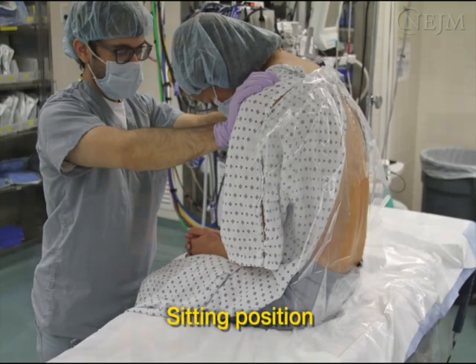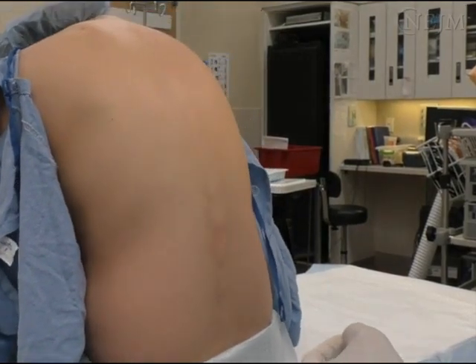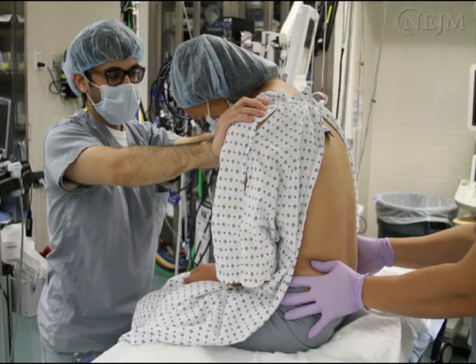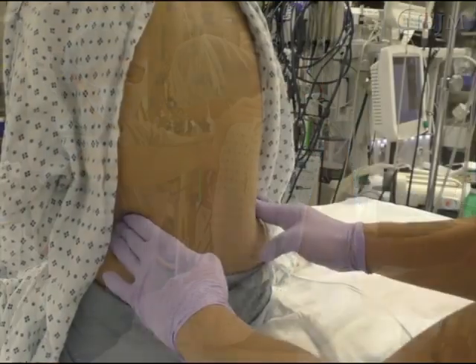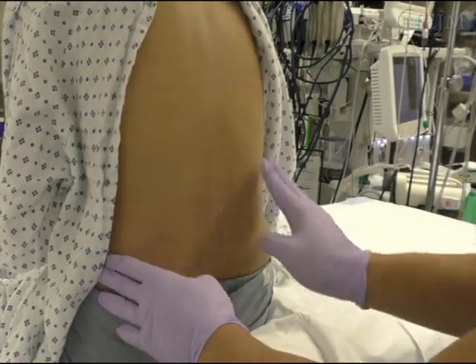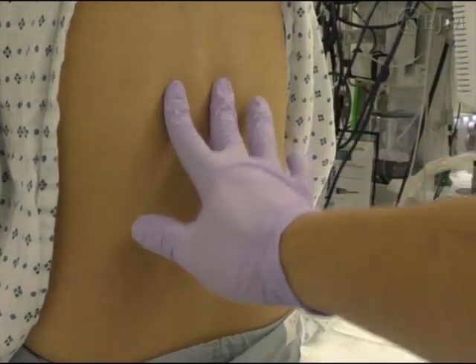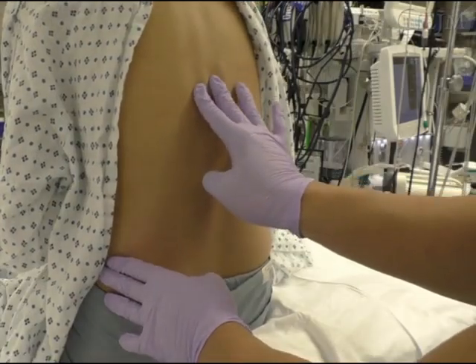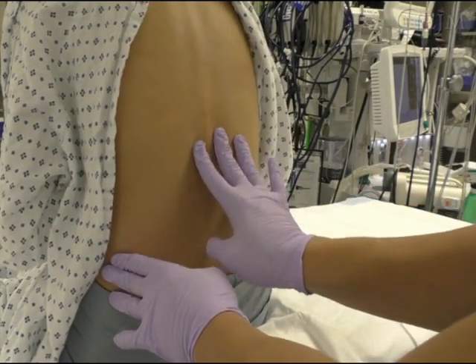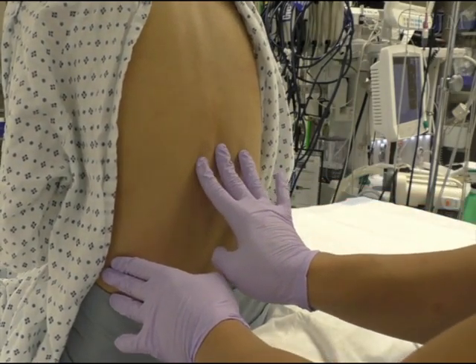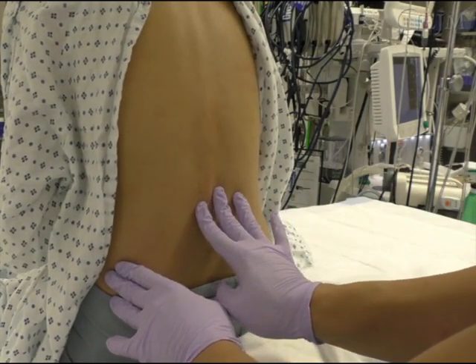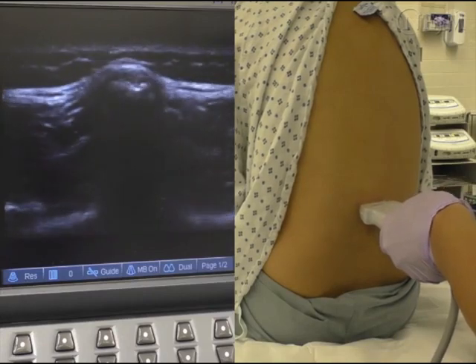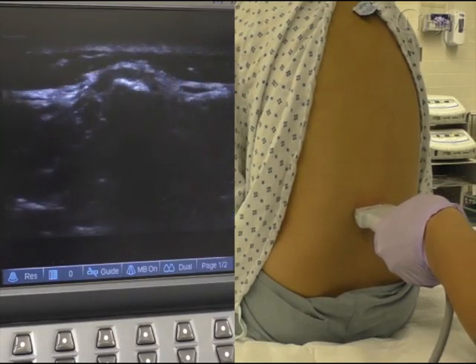To place the patient in the sitting position, have the patient maximally flex his or her back, then instruct the patient to relax the shoulders, flex the neck, and lower the chin toward the chest. Once positioned, begin to palpate the anatomical landmarks of the back. Palpating the thoracic spinous processes first may help find the midline more easily and may reveal any abnormal curvature such as scoliosis. Recent literature supports obtaining pre-procedure ultrasound of the back to identify the midline, particularly in obese patients.